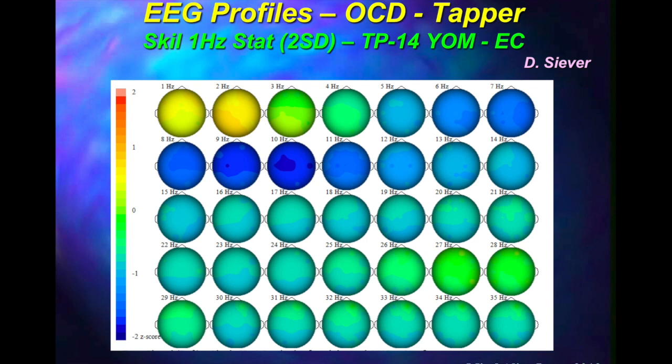Now, this is processed in a database, so it's z-scored, and we see he has dropped out at alpha. He has really no alpha to speak of. Everything else is pretty good. So unlike the gray matter, white matter type of injury, where you'd also see beta really dropped out and you'd see high theta in the 2, 3, 4 hertz range on the database, he mostly shows an alpha dropout. Thalamocortical loop is disconnected.